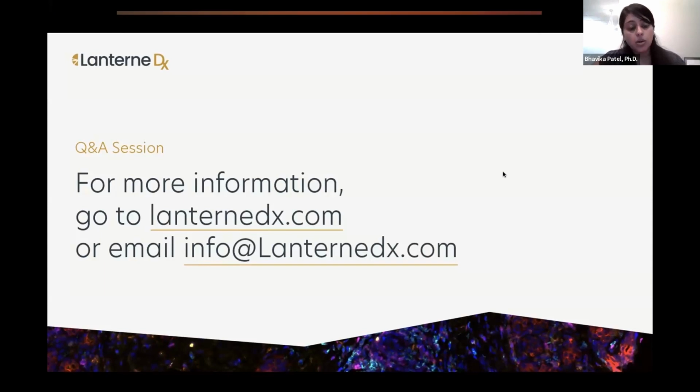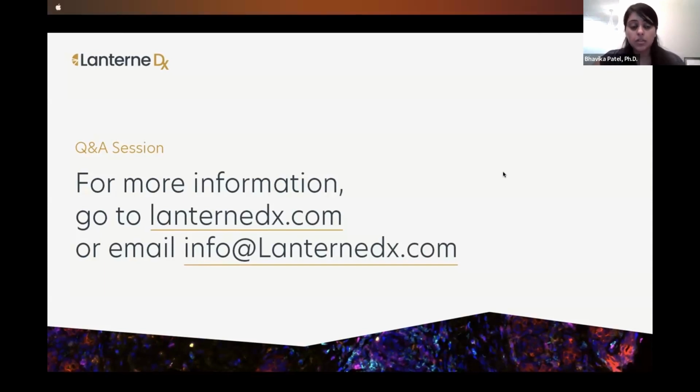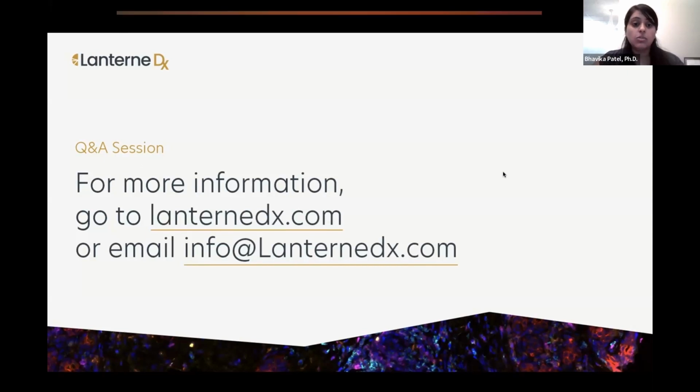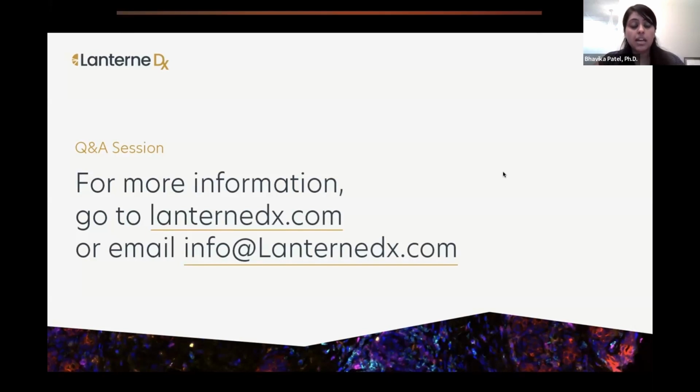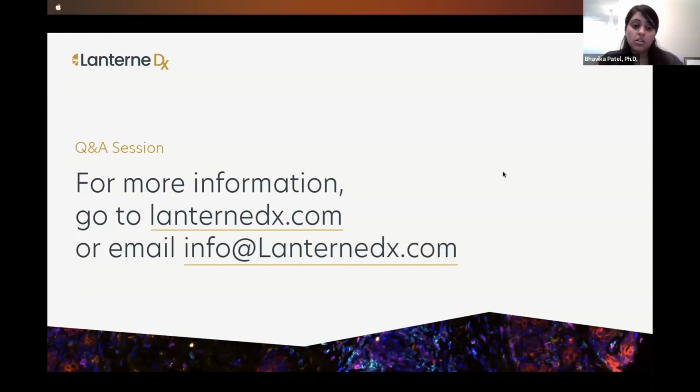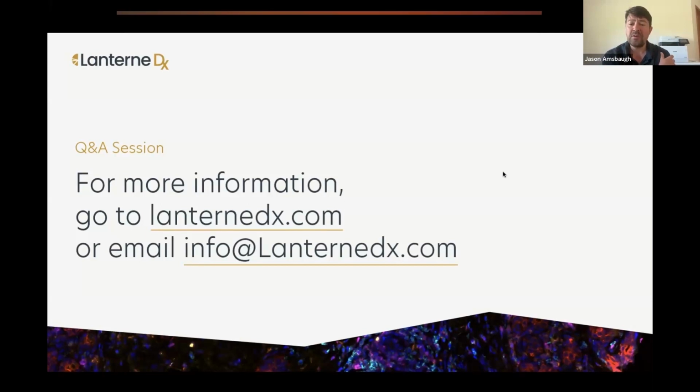And then we use the Akoya inForm software, and we can correct for that autofluorescence by selecting the most autofluorescent region in the naive tissue, and then going into the sample tissues and subtracting it. So you can see background, but we do a good job at making sure our quality controls can subtract it. Gotcha, thank you. It looks like we just have one question left in the queue. Any attendees, if you have any other questions, please put them in.